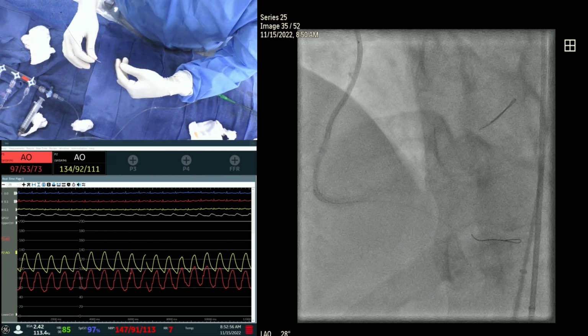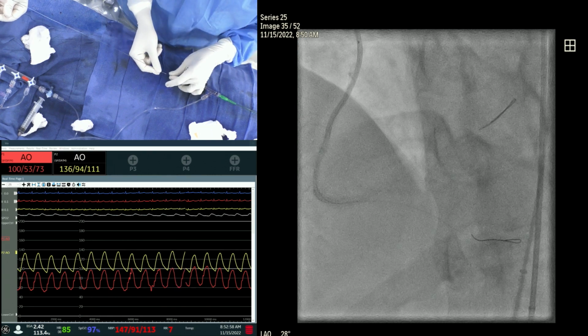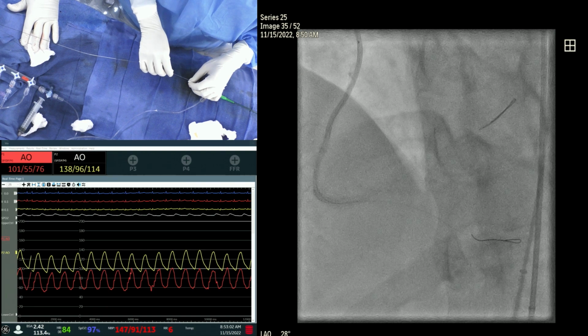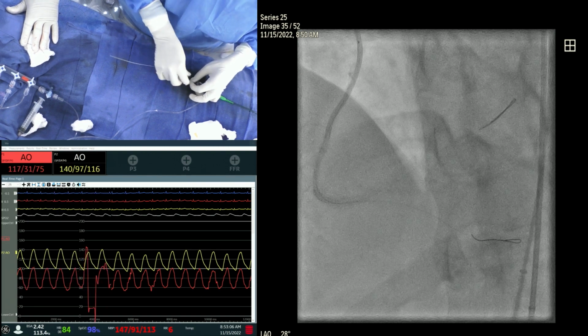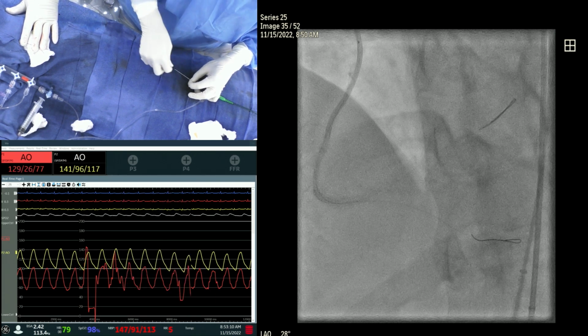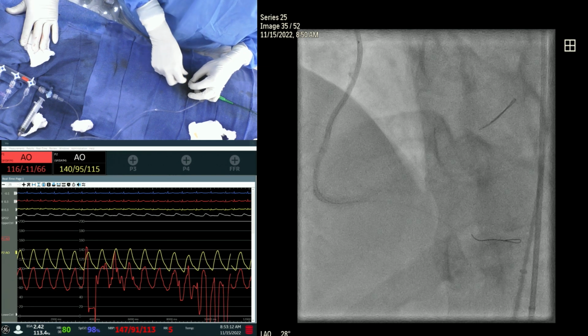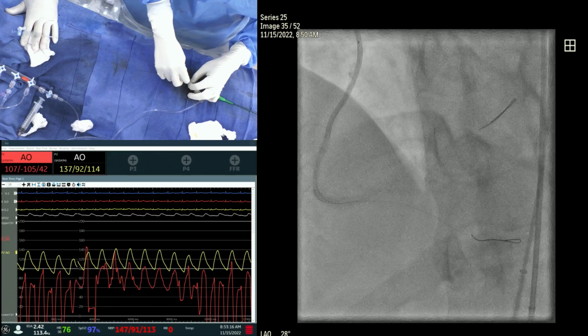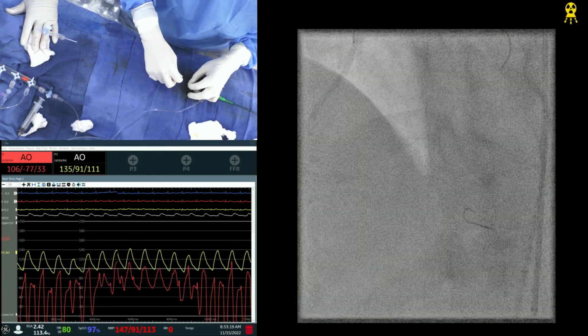If you put a short 2.25 by 12 in the AV continuation, let's see, this goes very well. Keep going. This is going to the PDA. I'm talking about the AV continuation because the ostium is still a little dissected. There was disease to begin with. And with the 6 French, you can put a mini crush. Mini crush requires 7, but 2.25 and 2.5 can go through it.